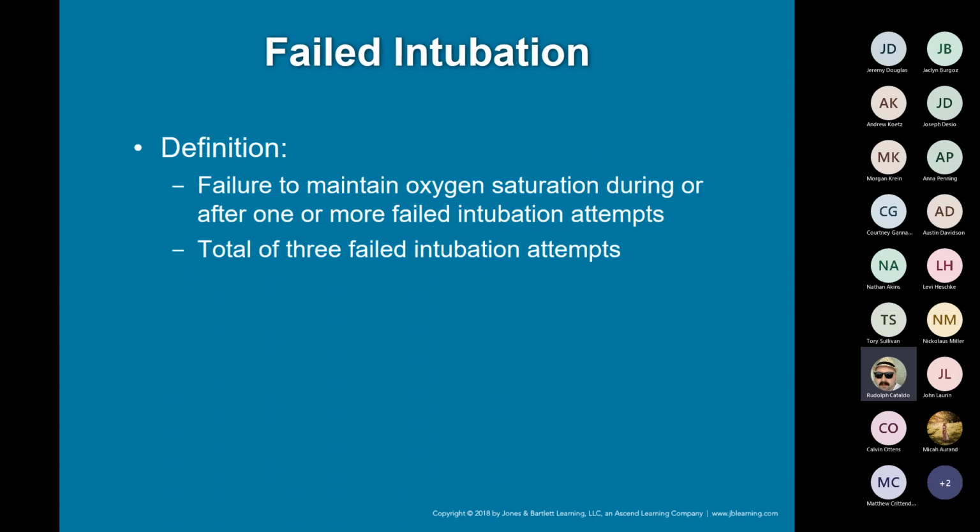Now, you will have times when you fail an intubation. A failed intubation is described as you went to intubate somebody and at the end, the tube did not end up in its place. That doesn't mean that you attempted and failed. It could be that you were looking and weren't able to see anything and you had to stop and pre-oxygenate your patient back up. You had to provide some breaths to your patient to get their oxygen sat back up before you attempt another intubation. That's considered a failed intubation.